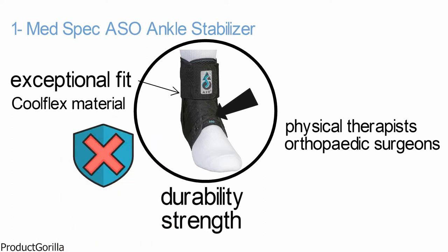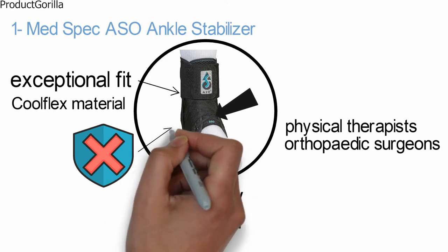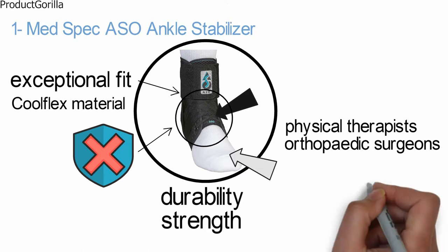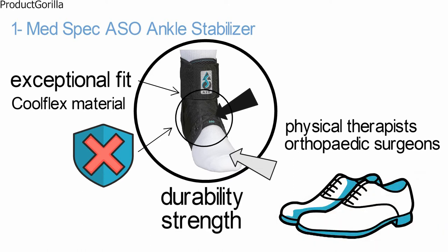For optimum support, stabilizing straps form a complete figure 8 to protect the ankle, with finger loops featured on each end. Elastic cuff closure further enhances support and keeps laces and stabilizing straps secured in place. The bilateral design and low profile provide a natural fit with both left and right foot and any type of shoe.